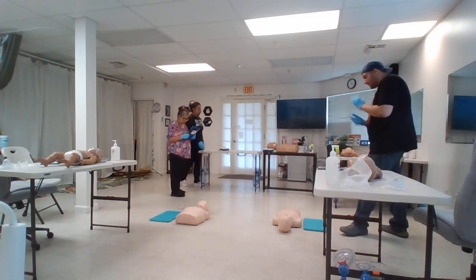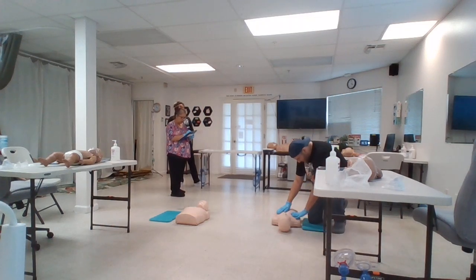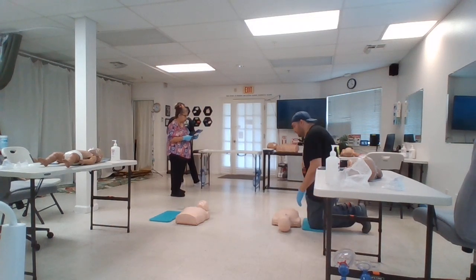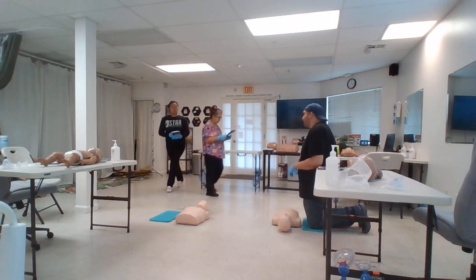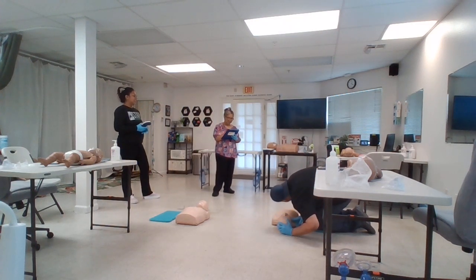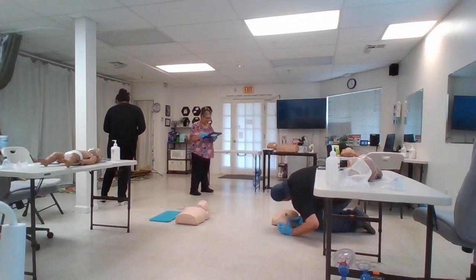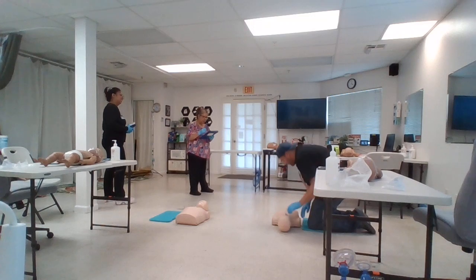It's safe. Hey, you okay? She's not responding. Casey, call 911. Get an AED. Bring it back to me, right? All right, checking for breathing. 1, 2, 3, 4, 5, 6, 7. She's not breathing, has no pulse.